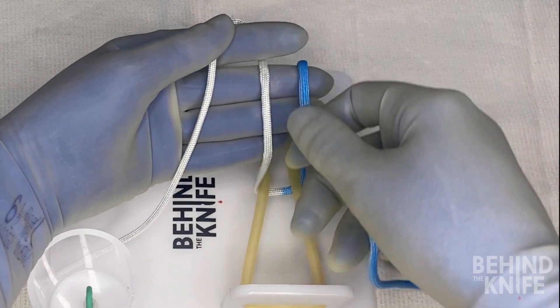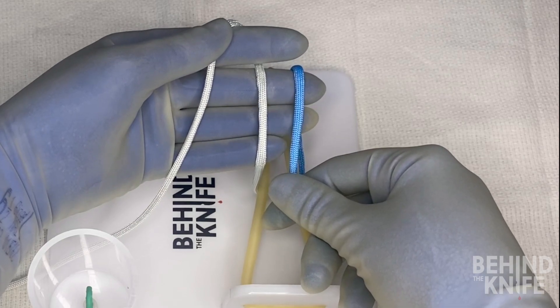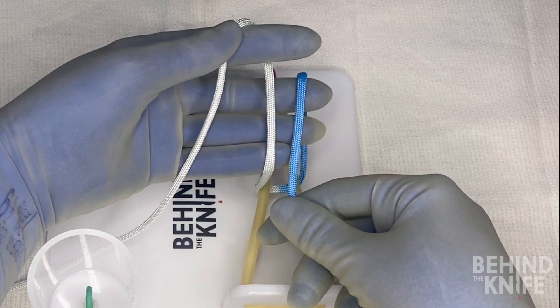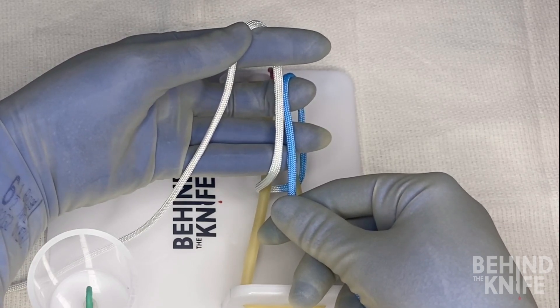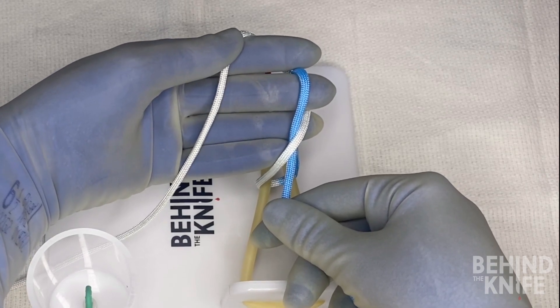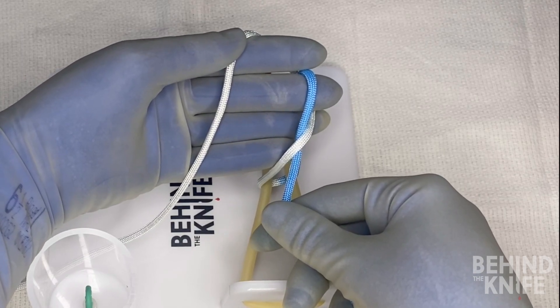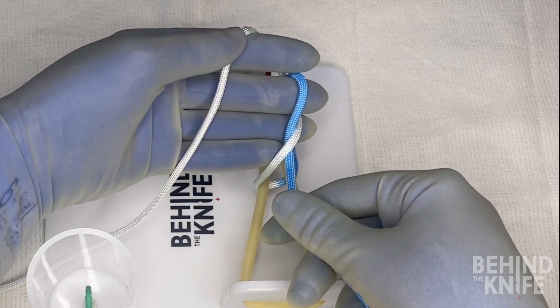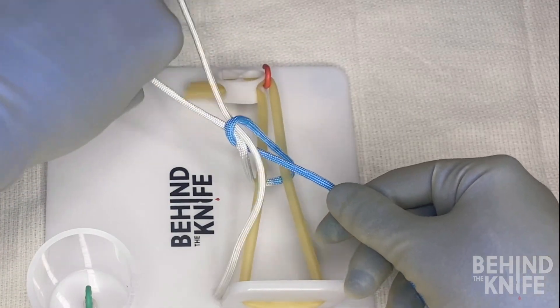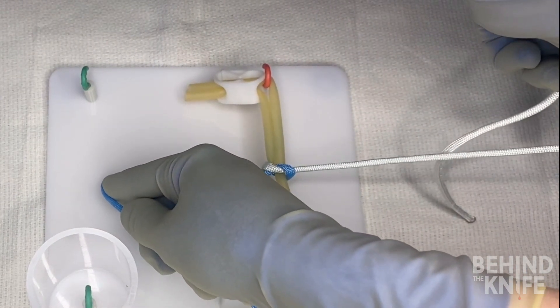Next I'm going to take the right side of my string and drape it over these three fingers as well, and the two sides of the string should be parallel. From here I'm going to take my middle finger and pull the blue end of my string under the white string and then over top. Then with my middle finger and ring finger pinched, I'm going to pull the white end of my string through and cross my arms to lay down a square knot.